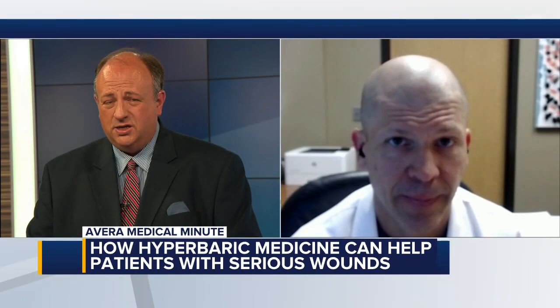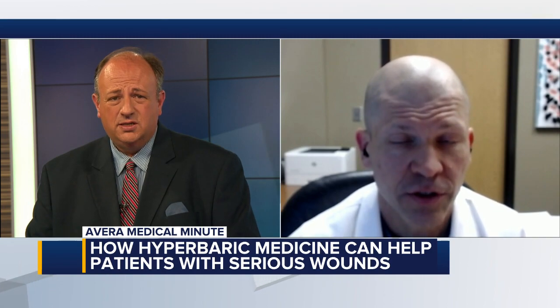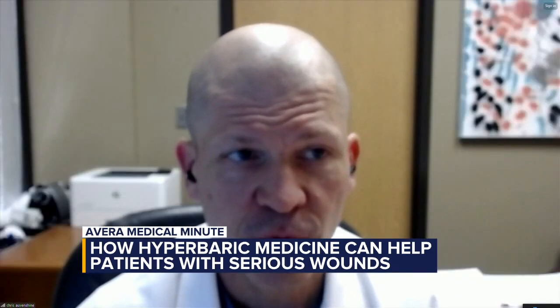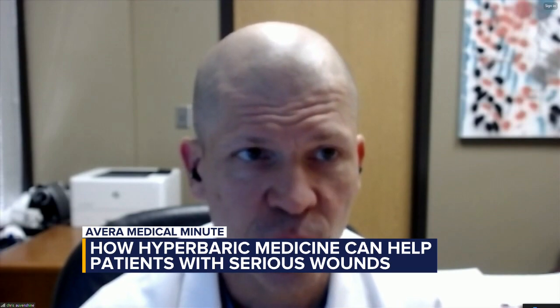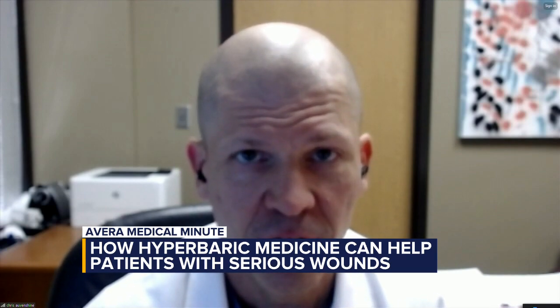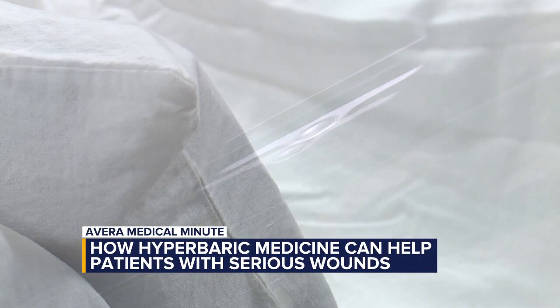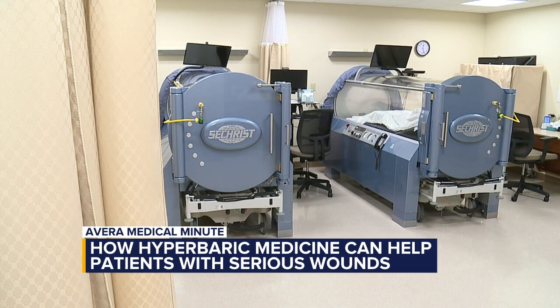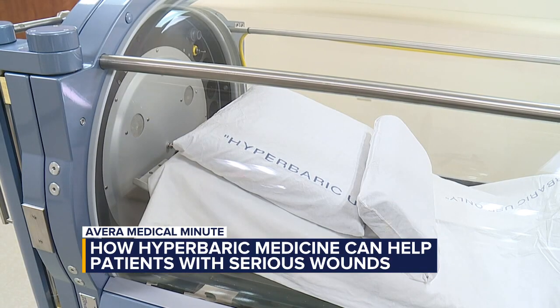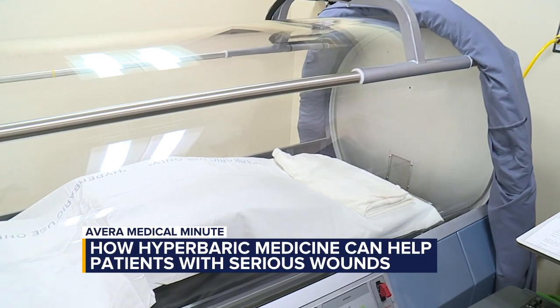Dr. Auvenshine, are there any side effects to this kind of treatment? Certainly. First and foremost, and when you say jarring, most patients will feel the effect of the pressure on their eardrums. Just as if you are landing in an airplane and you feel the pressure on your ears, patients will feel that pressure when the pressure is increasing inside the chamber. So we teach them how to equalize that pressure so that they can be comfortable.